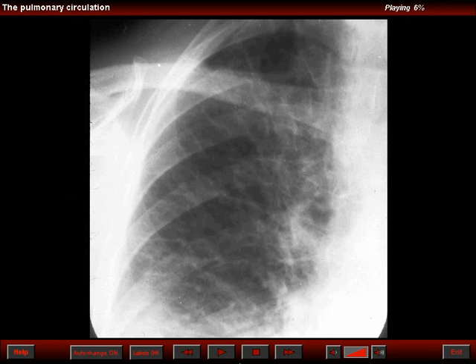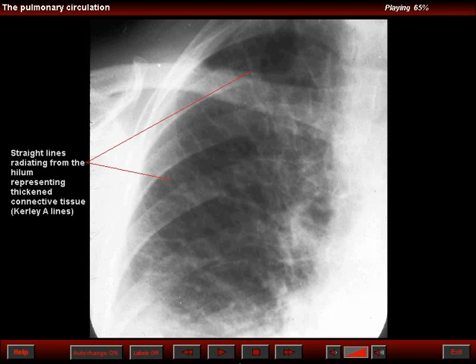Occasionally we can observe straight lines that radiate from the hyla. They do not branch and they do not taper. They represent the thickening of the axial connective tissue. In this case, a close-up of the right hilus in a patient who had interstitial pulmonary edema.